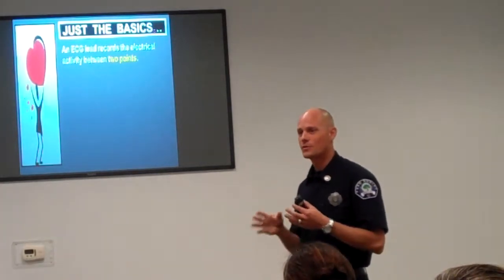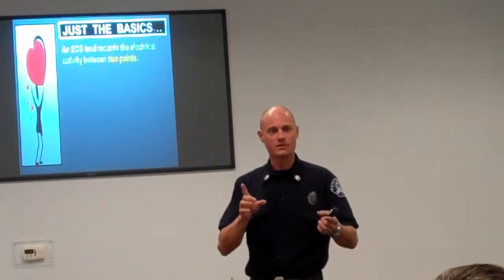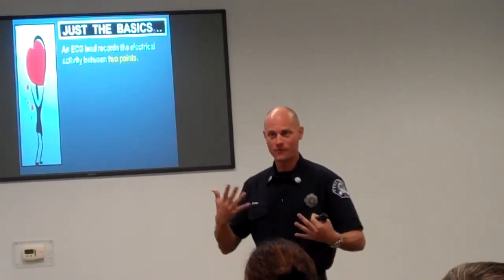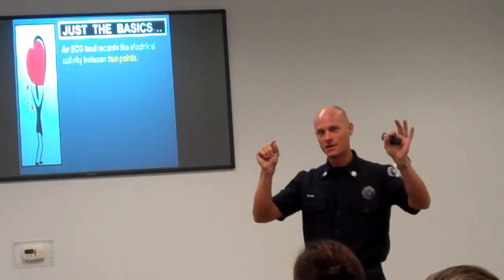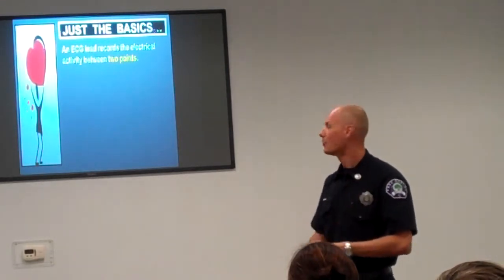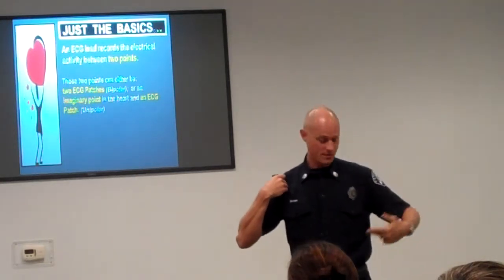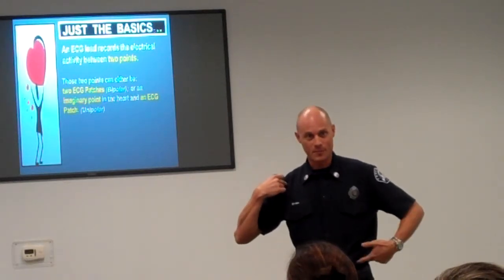So when we're looking at a 12 lead, when we're looking at any ECG rhythm, essentially what we're doing is reading the electrical impulse from one point to another, right? So even though we have a 3 lead or 4 lead, we're essentially reading between a negative and a positive point. So always between 2 points. That's called a bipolar lead. If you have 2 patches, so let's say patch here, this is standard lead 2, right? We're reading between a negative and a positive.